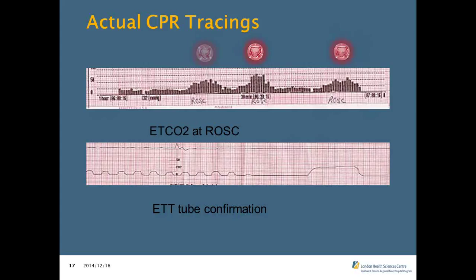You can see those sudden jumps where you see it trending upward, probably good CPR, and then suddenly it jumps quite high, and that would be an indicator of potential ROSC in these patients where you see that large jump, roughly on this scale, from 25 up to almost 50 between the two readings there, if you look at the middle one in particular.